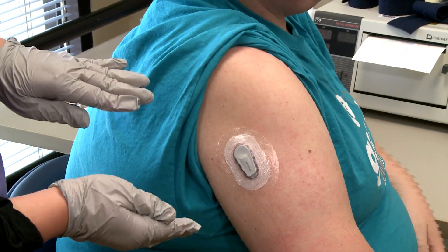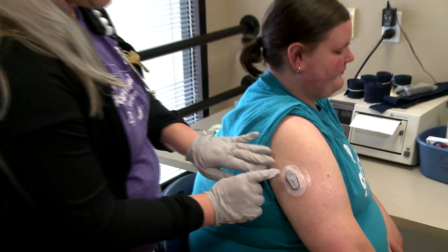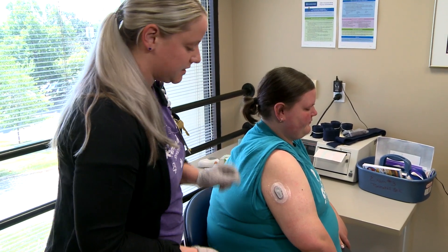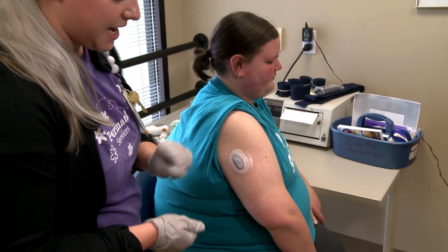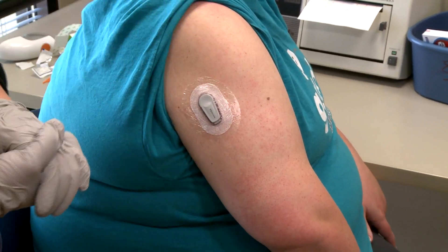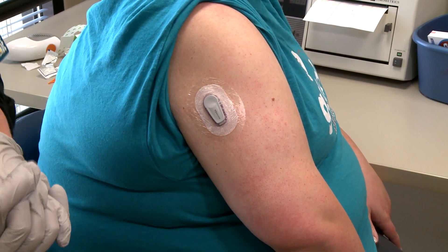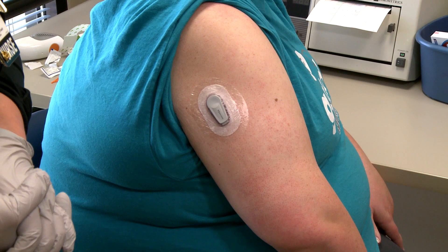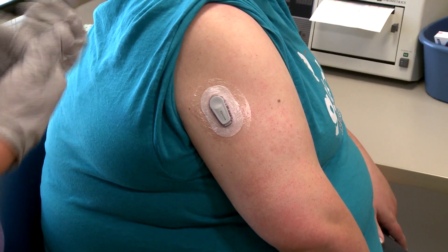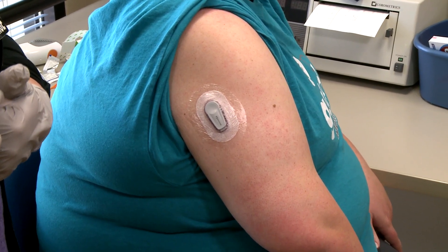This is going to be good for 10 days, like I said, so then you'll switch to the other side in 10 days. The little gray piece is good for three months. So when you go to remove it in 10 days, you'll just rip this off like a band-aid, but you'll want to take out the gray piece and hold on to it to put it into your next sensor. When you put a new one on, it takes about two hours to start reading your blood sugars, so you can't see them right away, but in a couple hours you'll be able to. And then we'll be sending you an invitation via email so that we have access to your blood sugars as well.